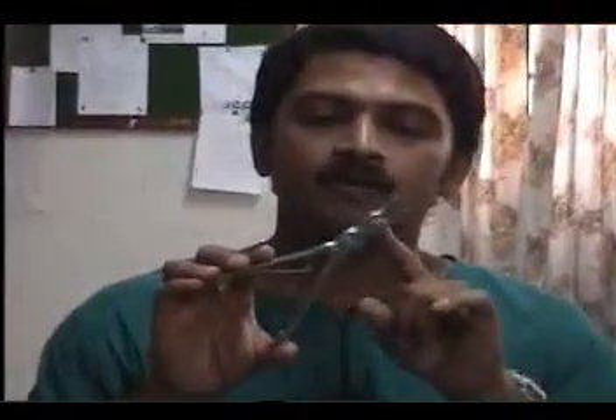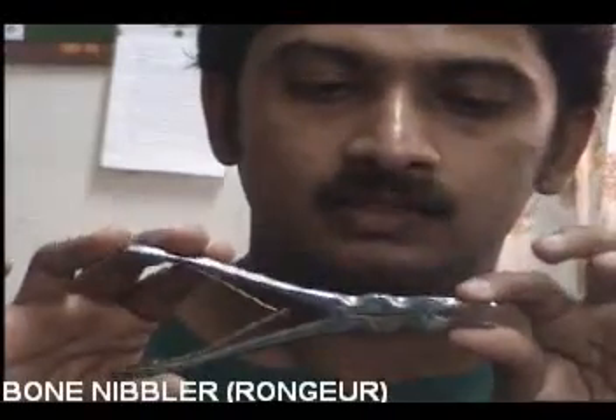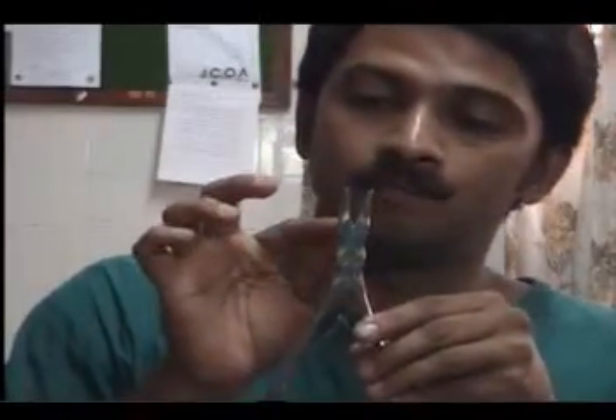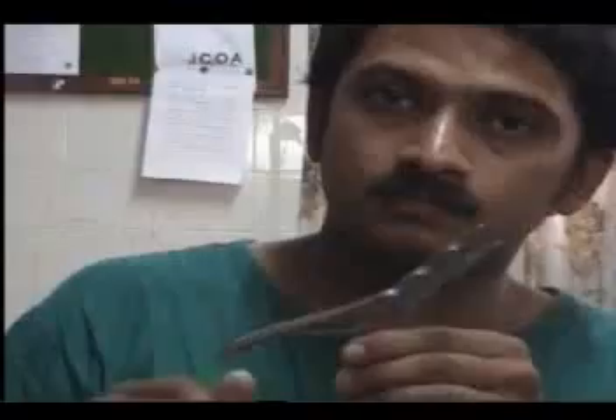The nibbler is very commonly seen and may have a single hinge or a double hinge to increase the leverage action — this is called the double action bone nibbler. There is no much difference in shape between an ordinary nibbler and a double action nibbler except the number of hinges. If you look at the nibbler, it actually looks like two spoons coming together. Depending on the hinge and the straightness, it may be a single action nibbler, a double action nibbler, or a goose neck or swan neck nibbler which has two bends. These are all used in different situations, but the mechanism is the same.